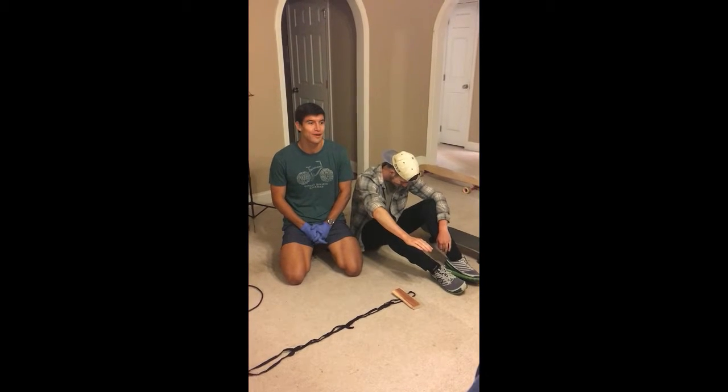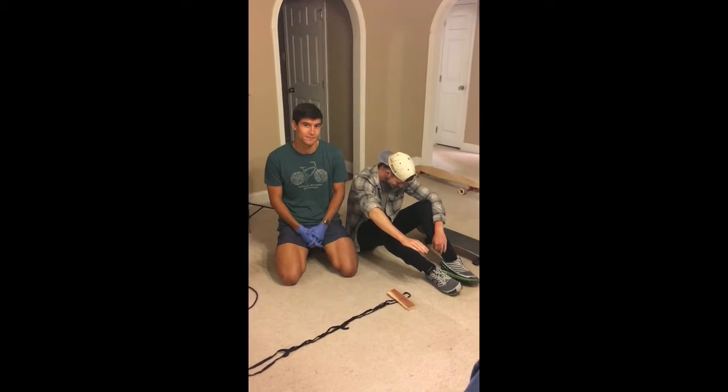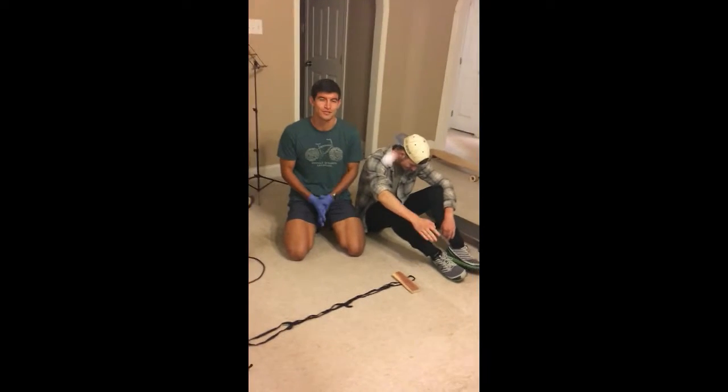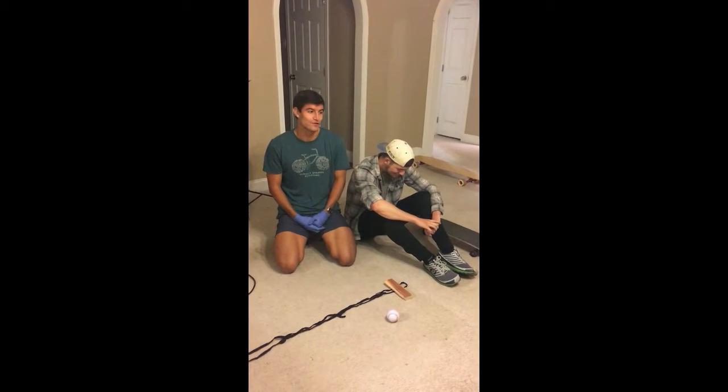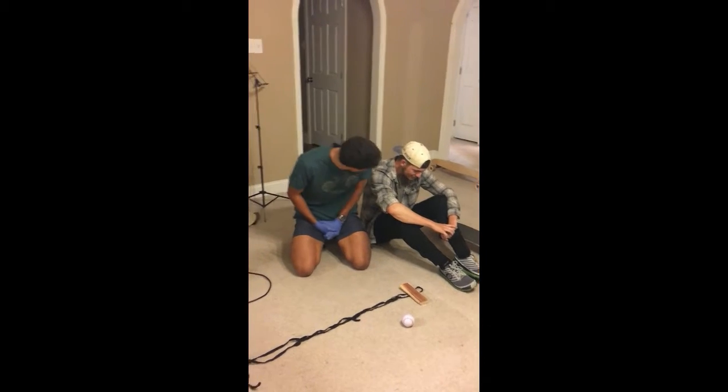Hi, my name is Thomas Bogle and today I'll be showing you how to splint an extremity. As you can see, this person — his name is Chance — hurt his wrist leading up to this incident. So first, we're going to ask if we can help him. Chance, can we help you?